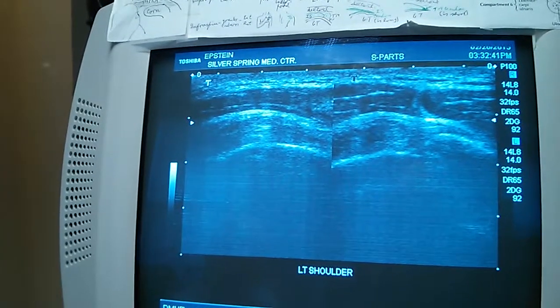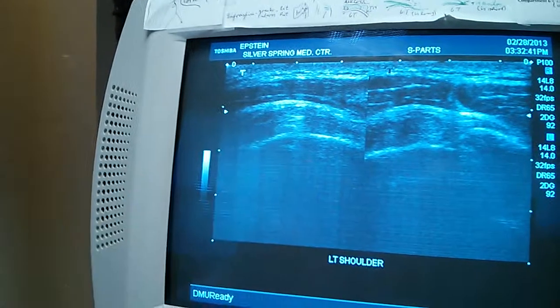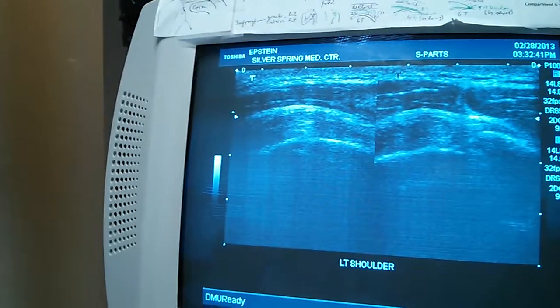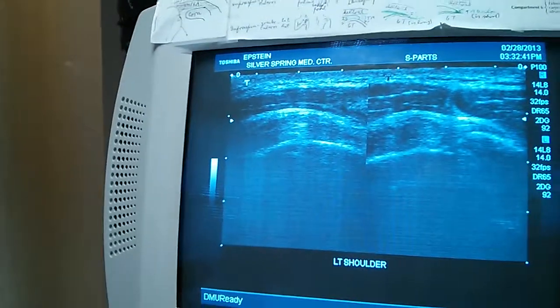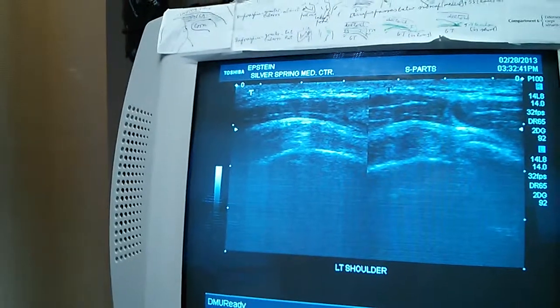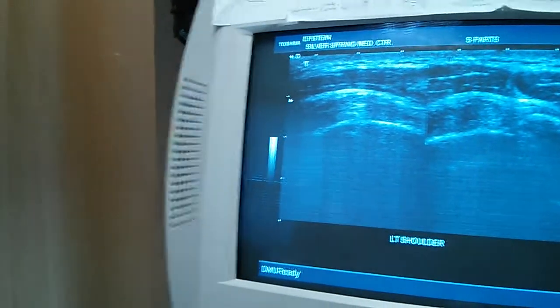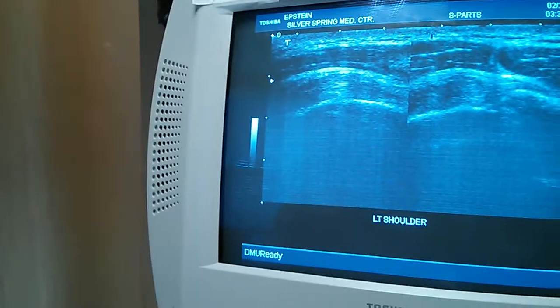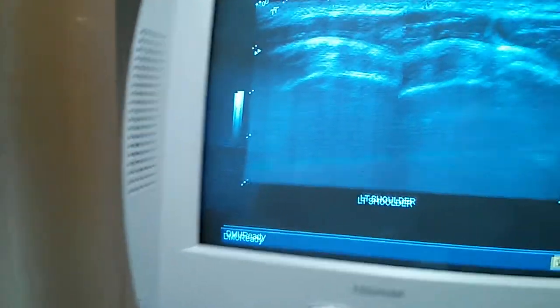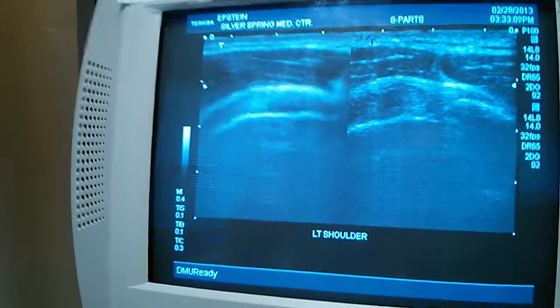Just looking at the biceps tendon lengthways. That's it crossways, that's it lengthways. So far, so good. The big issue was in the actual rotator cuff, so we'll get to that side, but we've got to do the thorough. Dr. Melmid, I can tell, is a thorough guy. Now, keep your elbow tucked in, but turn your hand outwards. No, keep it outwards, like that. Ooh, that gets you. There we go. All right, this is the real thing. This is where he earns the big bucks.